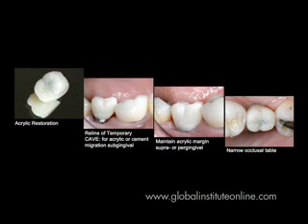One more time in summary. On the left picture you can see the acrylic restoration retrofitted with acrylic. Then we're going to do a reline of the temporary. As you can see, very carefully done, so no acrylic or cement migrates subgingivally. We're going to maintain the acrylic margin supra or pergingival, so there's no wound injury, and we're going to apply a narrow occlusal table so the occlusion can be limited as much as possible.